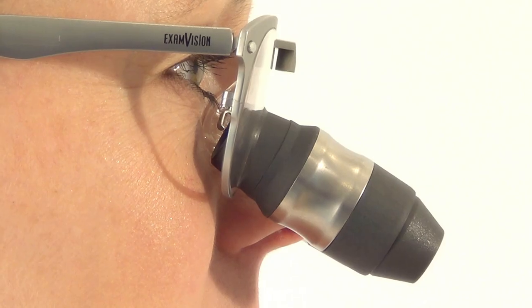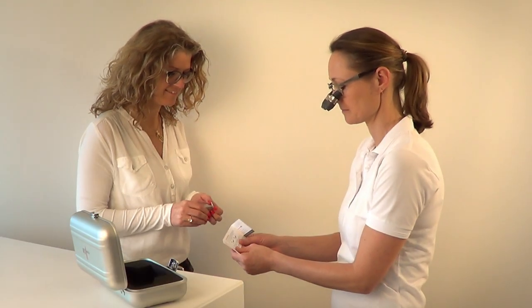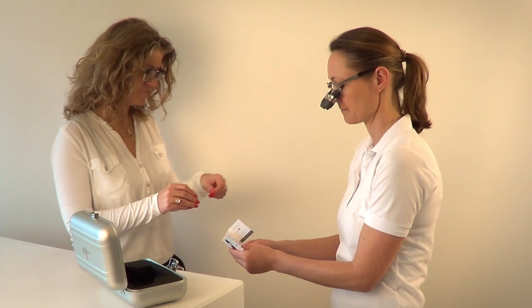Your loop has a quality control card attached with your personal working distance written on it. Find this working distance with the measuring tape.